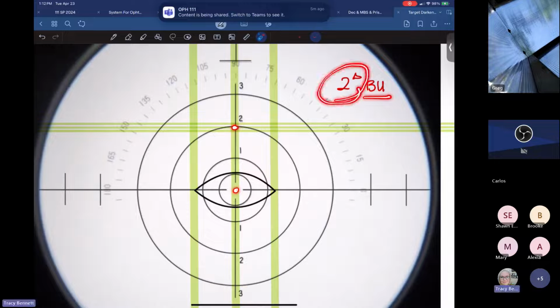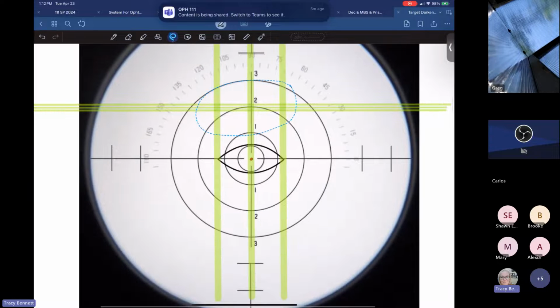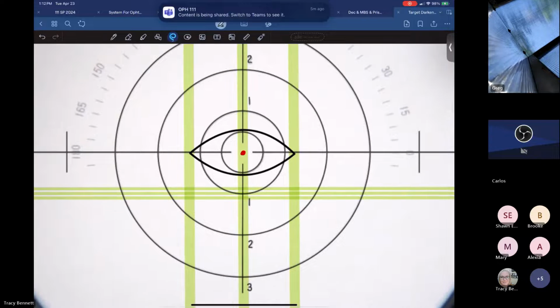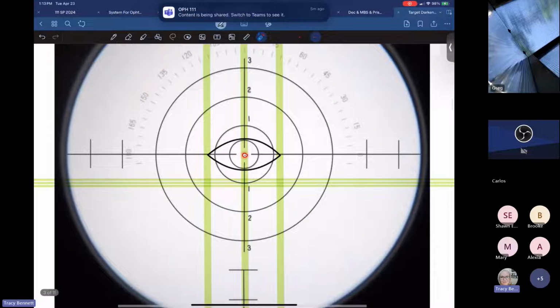How much? Where did we get the 2? That was using those prism reticle scales. So we are falling right at the 2, and so we are falling right at 2 diopters base up. All right. And if you see this much in the lensmeter, okay, first things first, we've gone down below the line or the central point here.